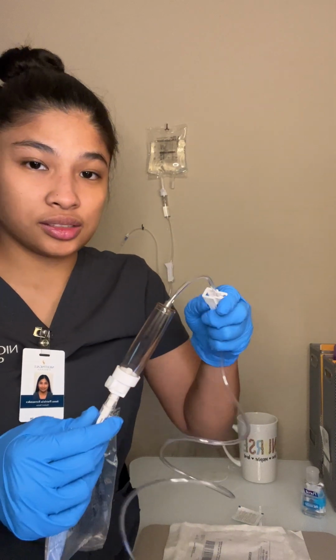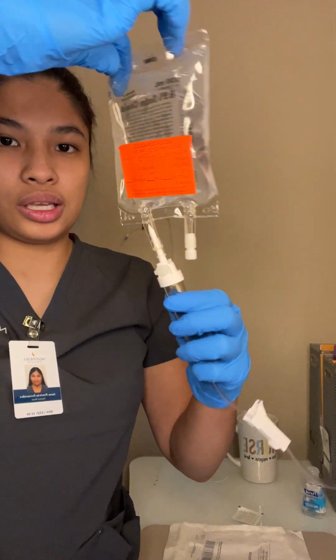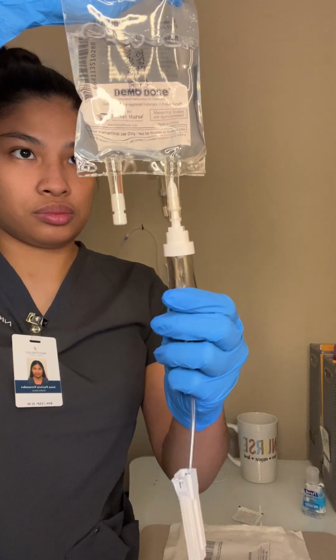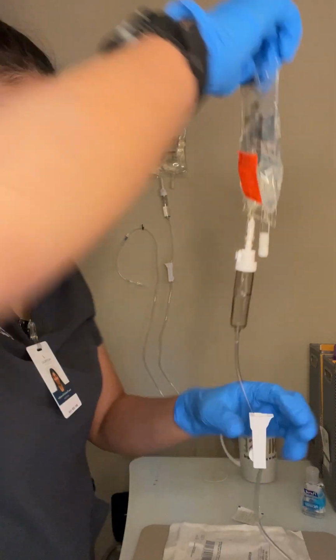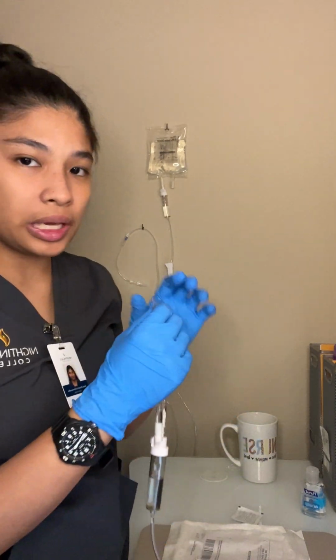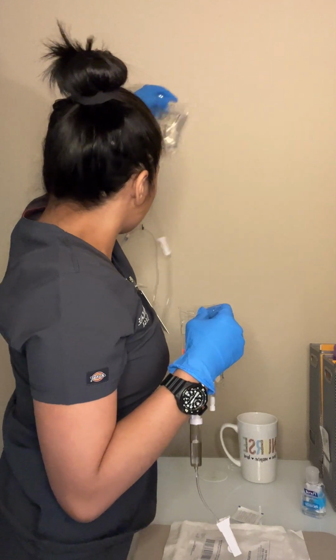Making sure again to clamp the roller clamp, filling it halfway. Since this is a piggyback medication, this should be hanging higher than the fluid.